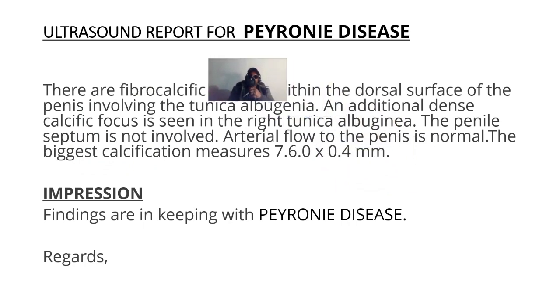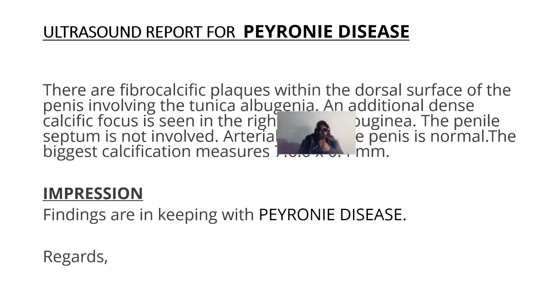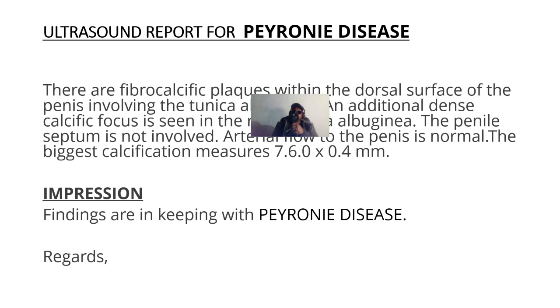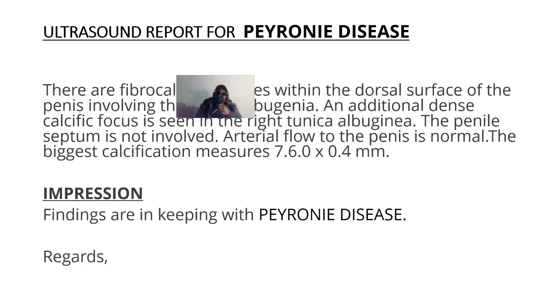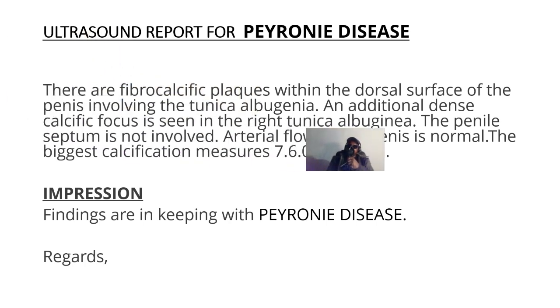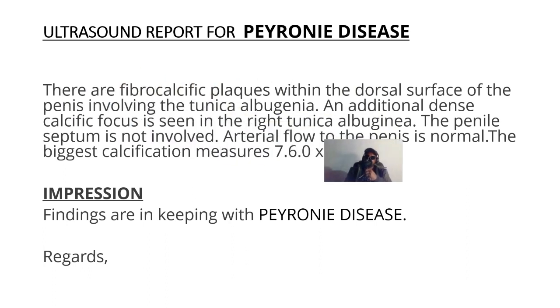So at times it's not necessary for you to give voluminous reports to your referring clinicians. They do a lot of work, they'll be so tired, and they might never read any or parts of the report. So it's necessary for you to summarize the major findings and give a short but brief and detailed report like this.